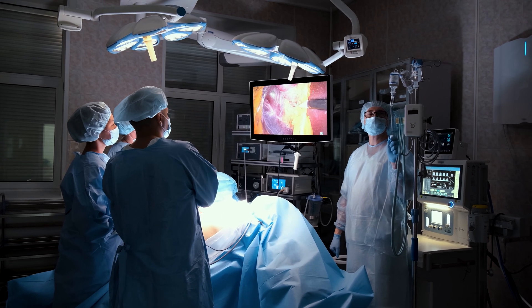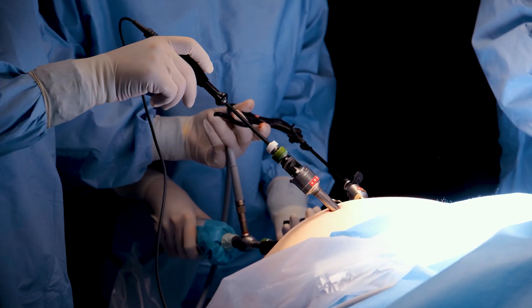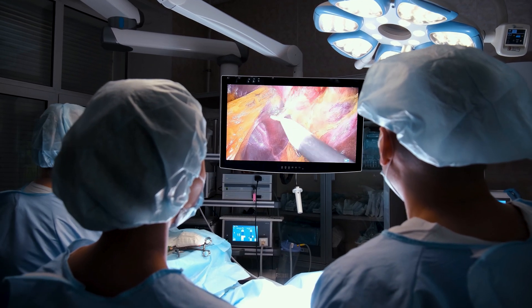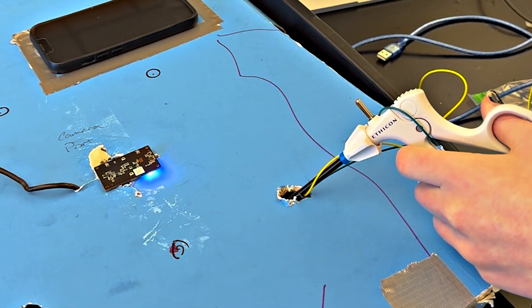Laparoscopy, or laparoscopic surgery, is a type of minimally invasive surgery. Instead of open surgery where surgeons cut open a large incision, they create just small incisions called ports where they insert specialized long tools called laparoscopic tools, so that they can perform the necessary surgery from outside of the body.